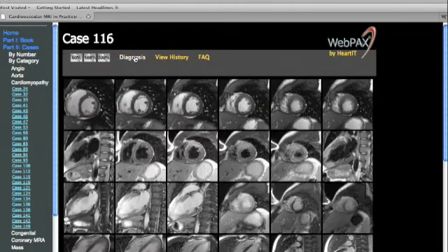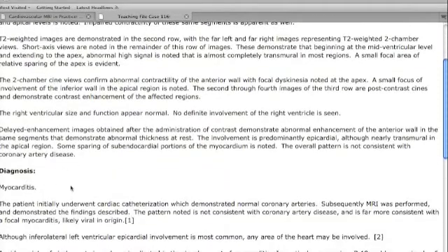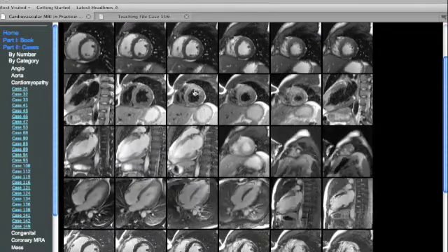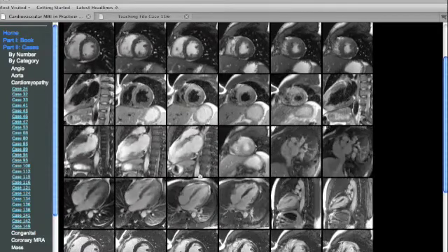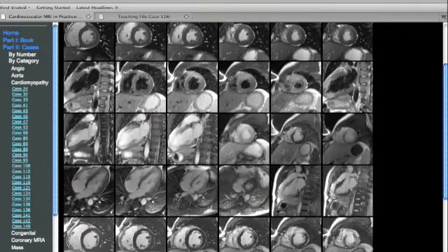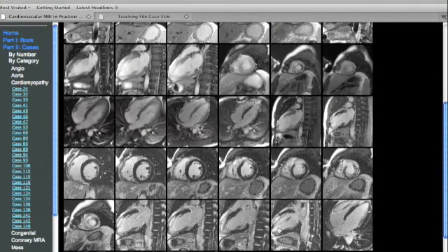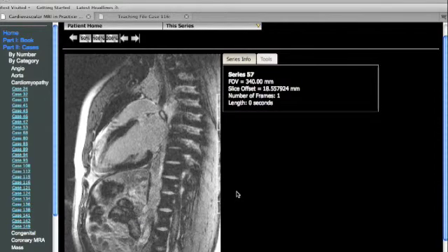One can then go and reveal the diagnosis, which is that this patient has myocarditis. He had undergone a cardiac catheterization, which demonstrated normal coronary arteries, and the myocarditis explains the abnormal high signal in the T2-weighted images, as well as the abnormal contrast enhancement of the anterior wall, as seen on the two-chamber views, which were noted to spare the subendocardium.